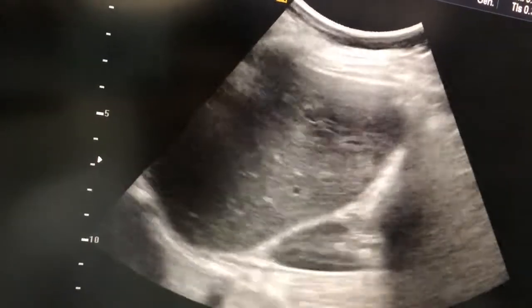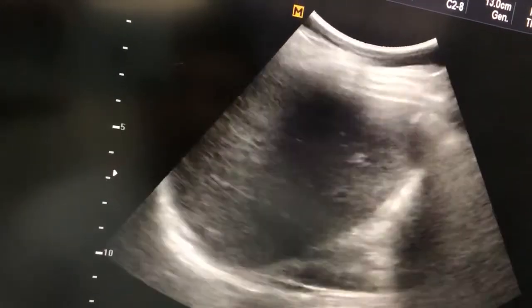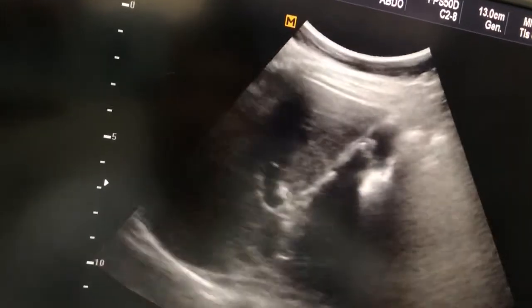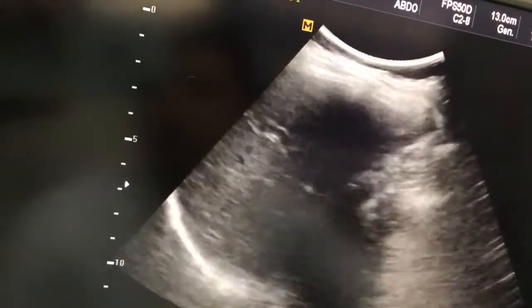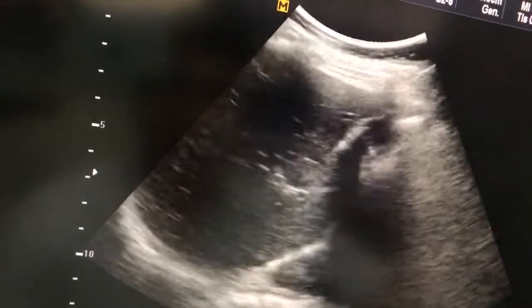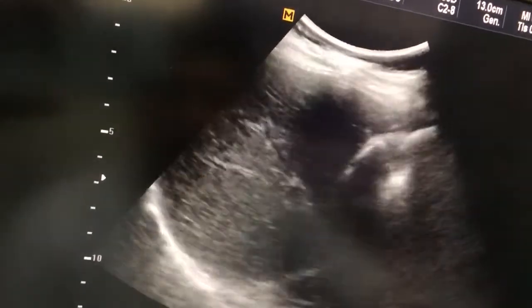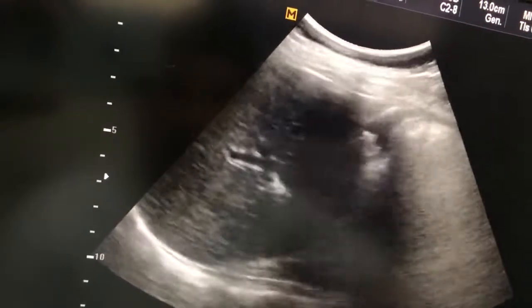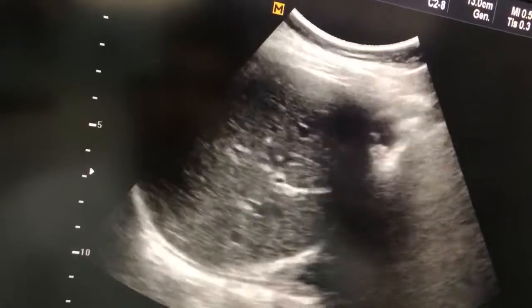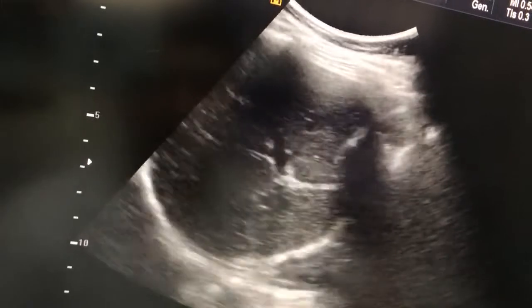And one more thing to tell you is that first of all you should know to take the proper longitudinal section of the gallbladder, then only you can make out this diagnosis. Otherwise intestine can also give a similar type of appearance when you have not seen sufficiently these type of cases. You will feel like the intestine shadow is also like this. But first of all try to visualize the normal gallbladder with proper anechoic lumen.